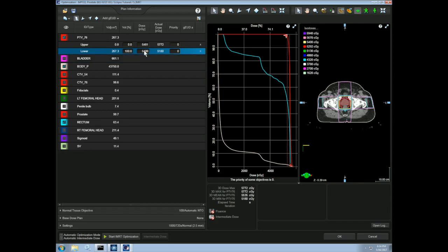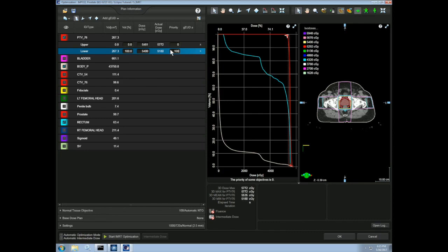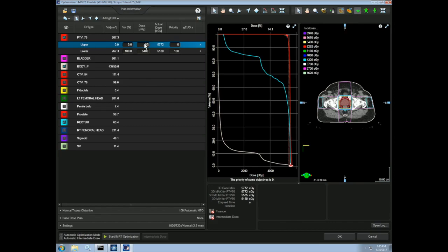Therefore, our dose here will be 54. Let's make the priority for this 100. I try to keep 100 as my maximum priority to simplify things, but the priorities are relative to each other and can therefore be set to your own preference. To keep the dose homogenous and to avoid excess hot spots, let's make our upper constraint such that 0% receives 105% of the prescription dose, which here is 56.7 gray. We'll use a priority for this of 100 as well.